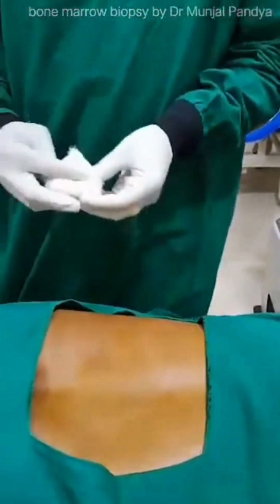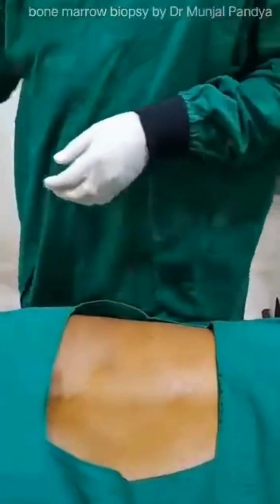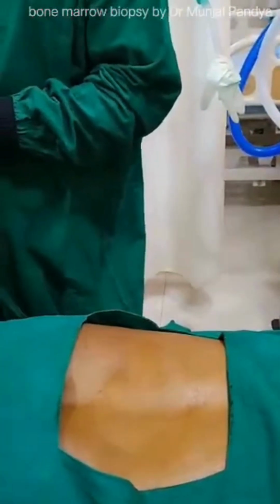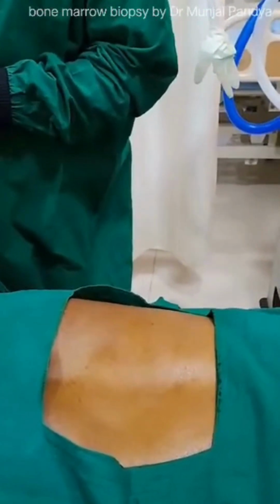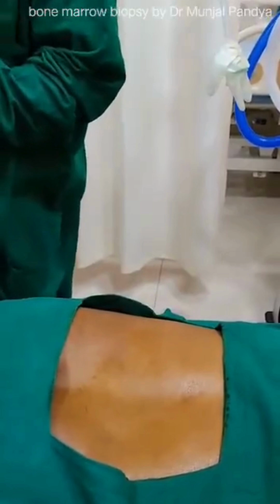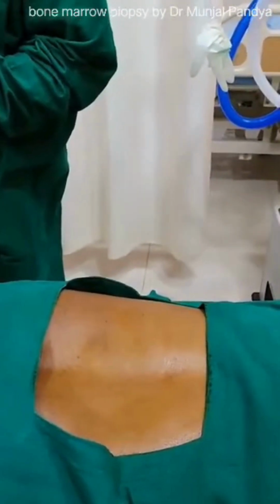Now we will be giving the local anesthesia with xylocaine 2%. The procedure is usually done under local anesthesia. So I am preparing 2% xylocaine. It's readily available. We usually give in an adult patient around 10 cc of local anesthesia with a syringe and needle. We will administer it to the local site, the posterior superior iliac spine.